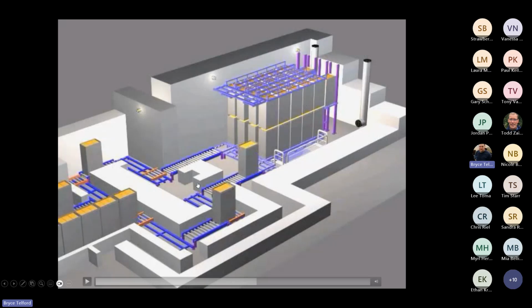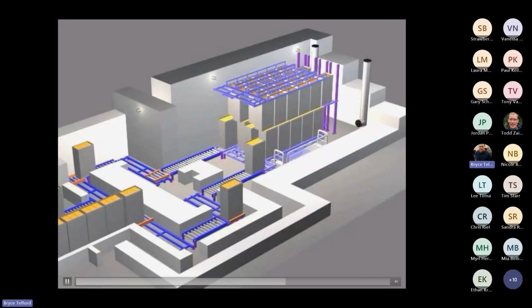A good way to think of it is we basically have a campfire here in the middle, and we're absorbing the energy from that campfire by sticking these carriers in various positions. They're going to shuffle to different positions, and they're going to dwell over time. So for gamma, generally speaking, our dose is directly correlated to time. The more dose we need, the more time it's going to spend in the chamber. The less dose we need, the less time it's going to spend in the chamber. But we're going to go through this overall shuffle and dwell process.